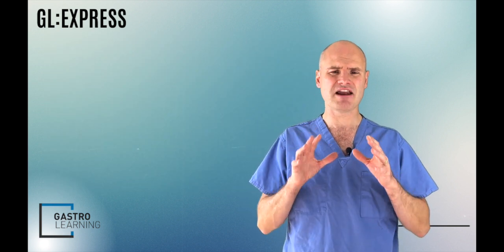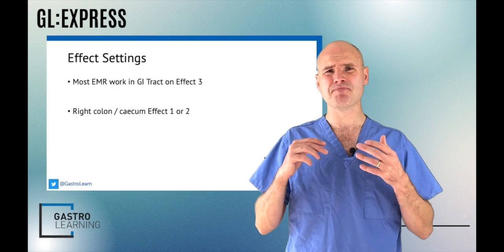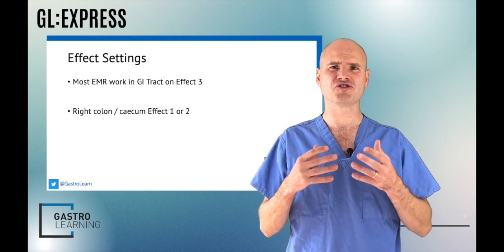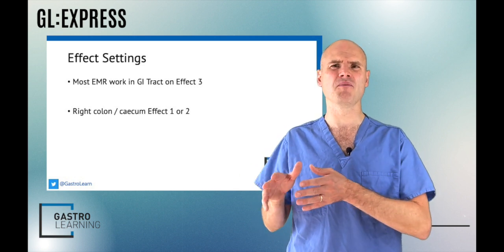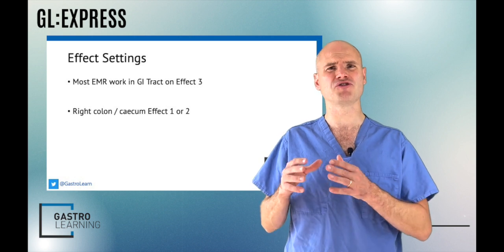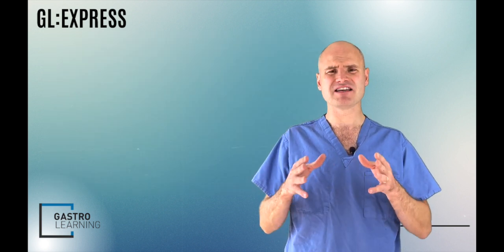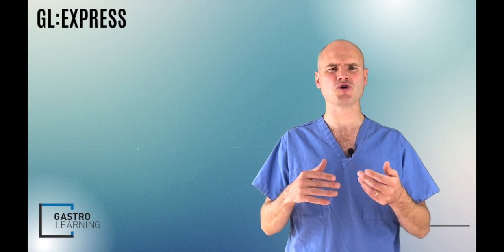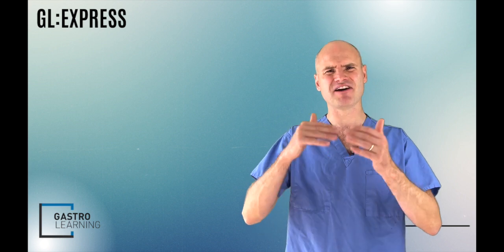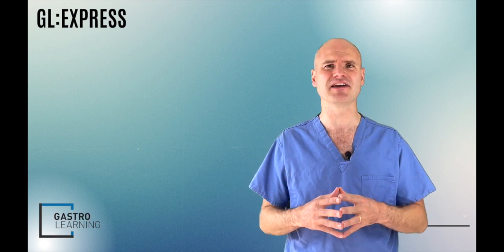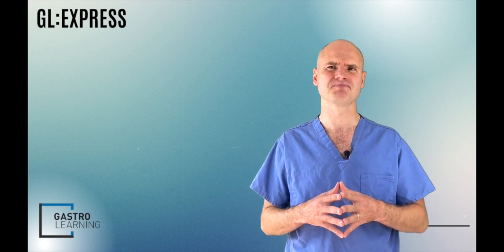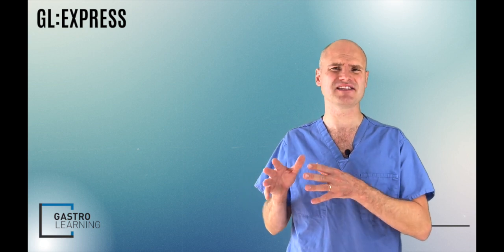Generally speaking, for esophageal, stomach, and most colonic EMR work, you're going to want to select Endocut 3. However, for the cecum or right colon you might want to select Endocut 1 or 2 depending on your preference. For ESD work you're likely to reduce that effect down to 2, because what you don't want to do is over-coagulate which shrinks your submucosal layers and makes it very difficult to differentiate the various layers. Of course you adjust these settings depending on how you're getting on and how the lesion's going. I'm not going to talk about ERCP work in this section because I'll leave that to my far more esteemed colleague George Webster.